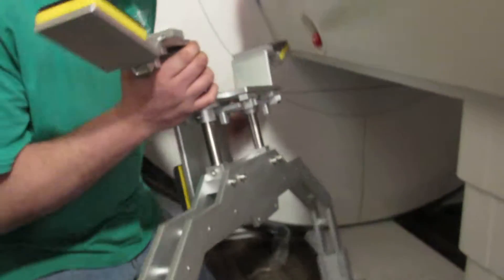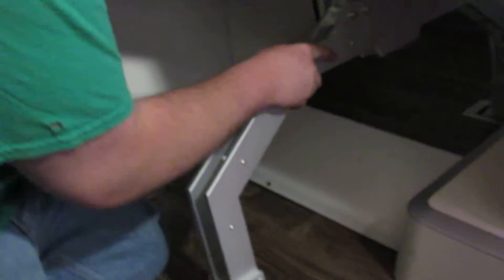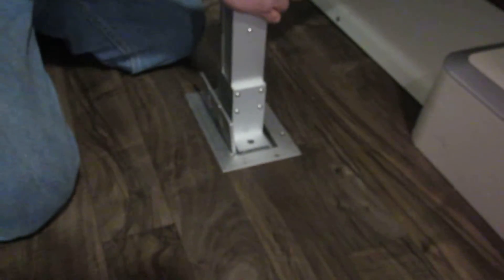Now we're going to show you how to put it back so you can see when it's ready for transport. All you got to do is take this bracket, lift it up over that plastic piece. You'll feel it fall right into the slot there.